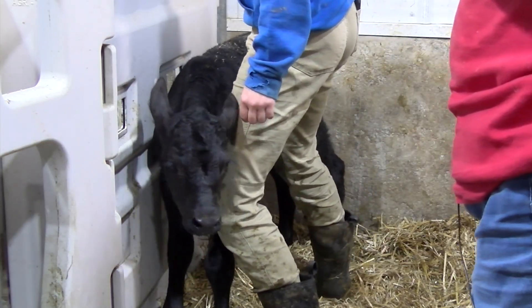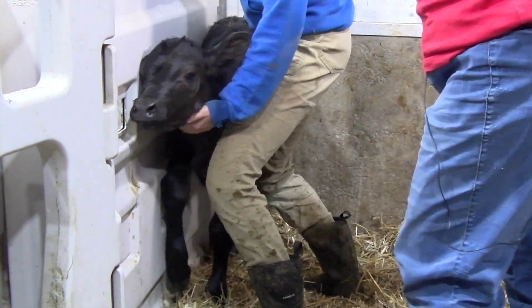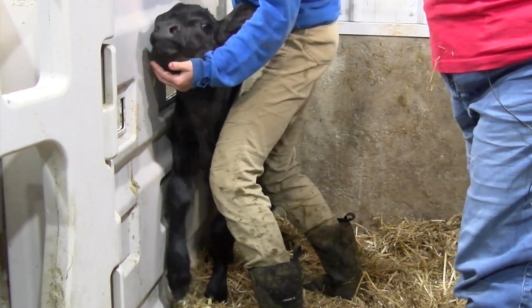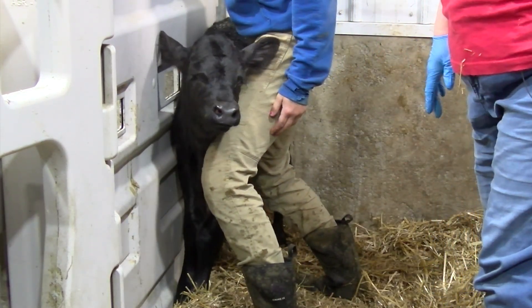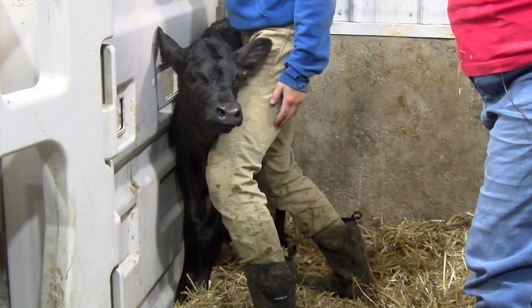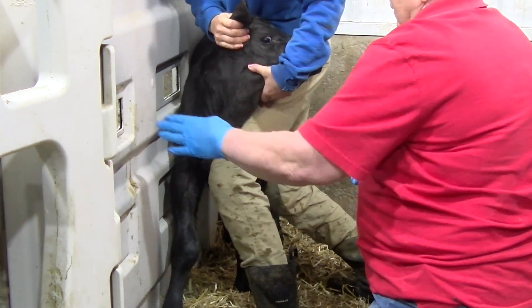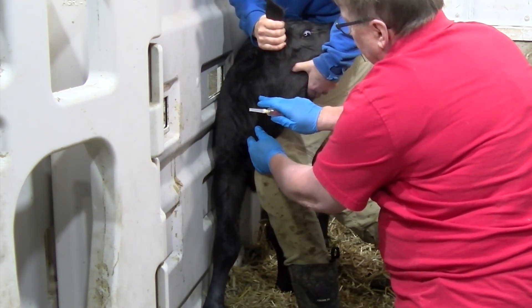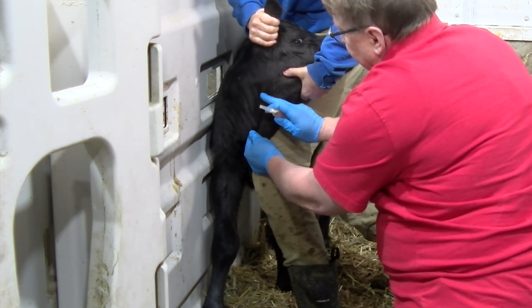To restrain the calf in a standing position, place the calf so there is a solid panel along its side and behind it so it cannot back up. The person restraining the calf will place their back leg against the animal's back flank and front leg against the shoulder. This allows the calf's head to be turned across the leg of the restrainer. Steps for drawing blood from a standing calf are the same as for a calf that is laying down.